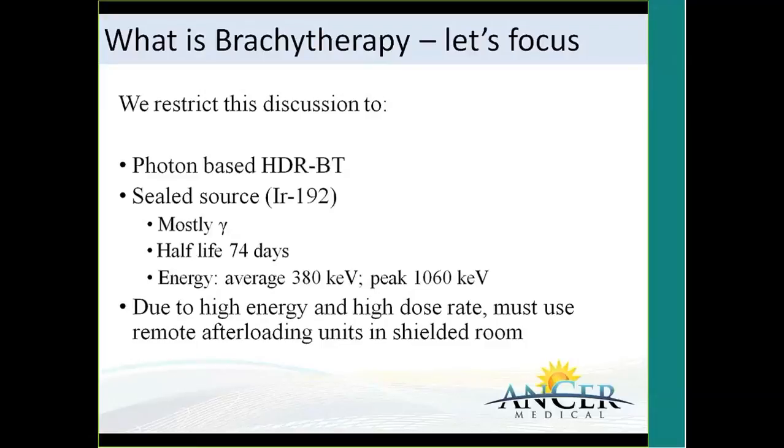Due to the high energy and high dose rate, you have to use a remote afterloader, and you have to use a shielded room. A remote afterloader is a unit, which I will describe, that houses the source and controls the treatment of the source remotely. So everybody except the patient is outside the room, and this is all done remotely.